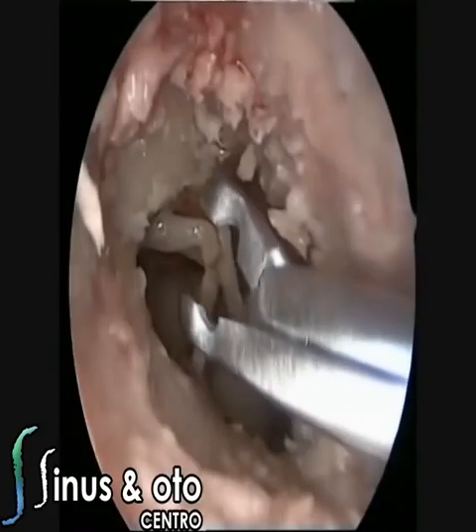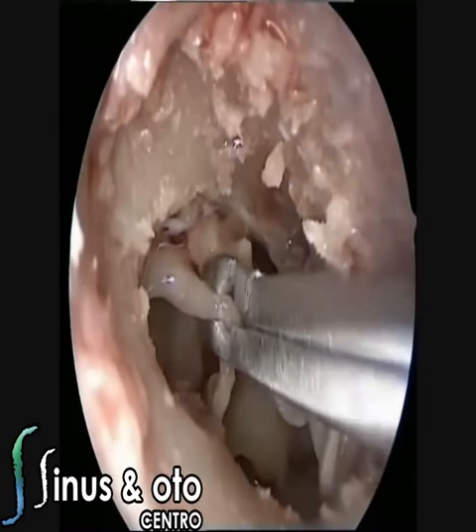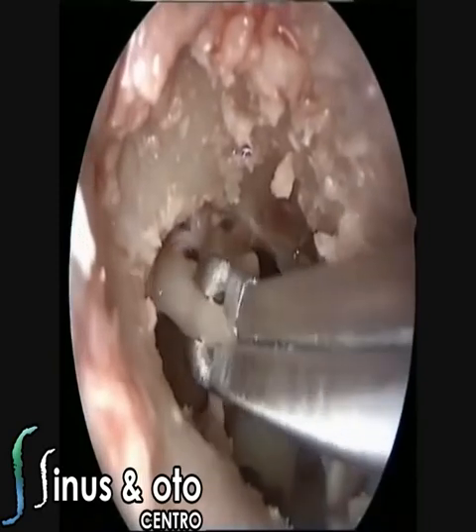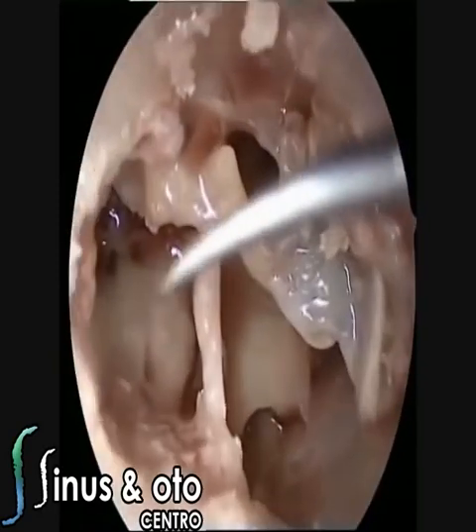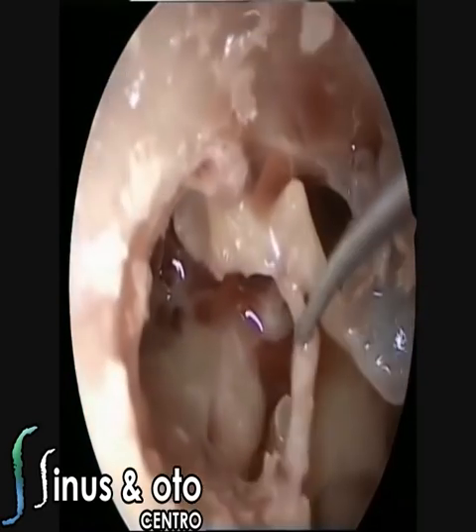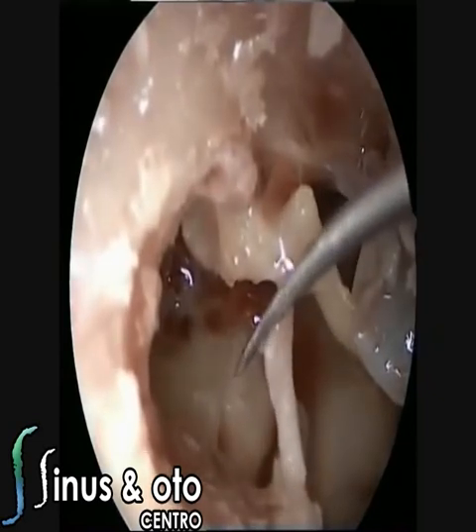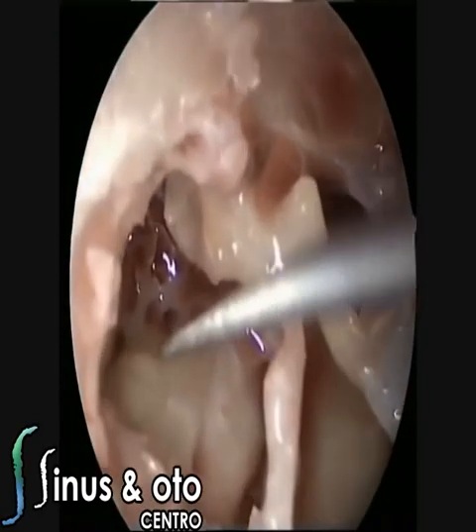So once you remove the incus, you gain a lot of ventilation pathways. It's like doing a maxillary antrostomy. You open a lot the antrum of the maxillary sinus. In this case, you open a lot the ventilation pathways. But on the other hand, just like in the maxillary sinus, if you do a big antrostomy, sometimes you can have problems. Here, if you remove the incus, you will need to reconstruct if you want to have a good hearing result.